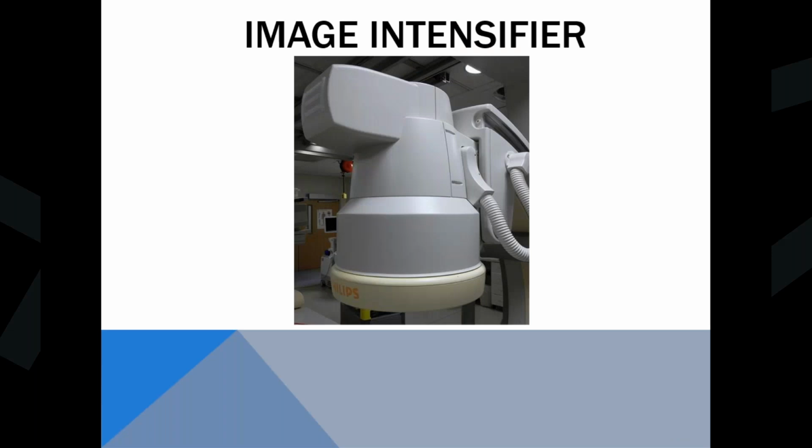So another system that they used, and conventionally pretty much from the beginning of fluoro up until maybe the end of last decade, sometime in the 2010s, the image intensifiers went away, and then pretty much everything turned to digital. Interestingly enough, it uses a lot of the same idea, even though it's analog.